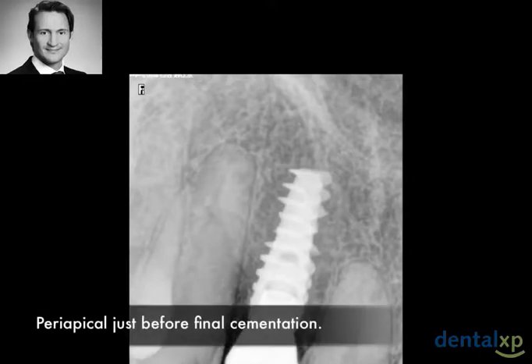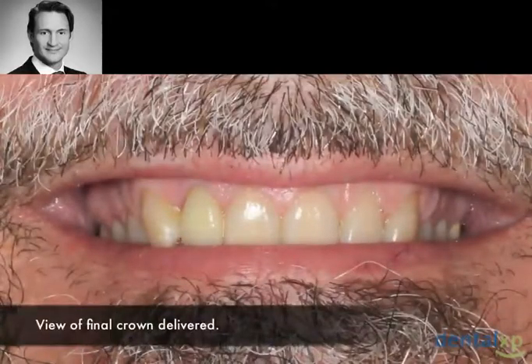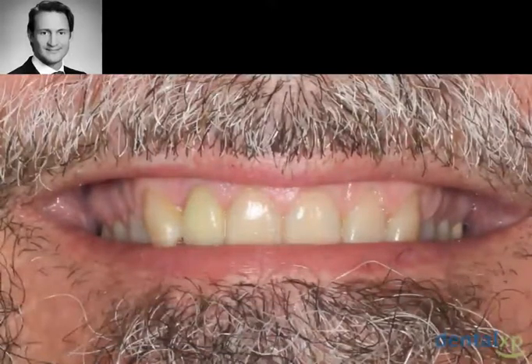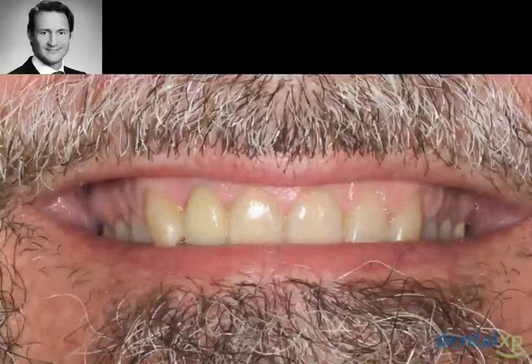Here's the final periapical of the area. This is approximately 3 months after placement and just prior to cementation. Here's a clinical photograph after final crown delivery and cementation. Patient was ecstatic with his results, and I have found a very high patient satisfaction level with this procedure.